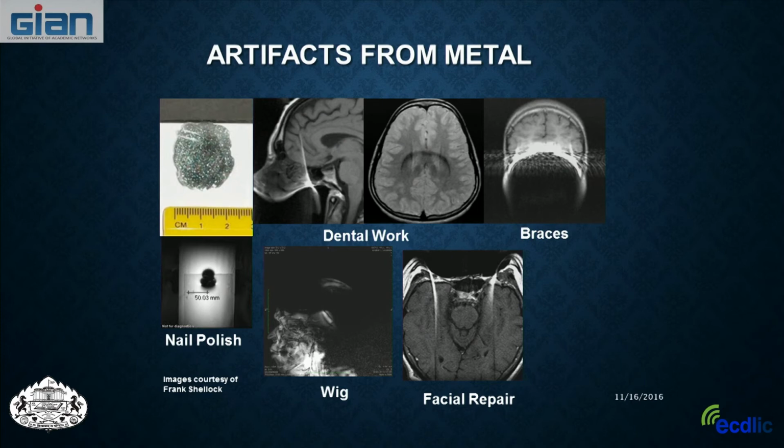When kids get braces to fix their teeth in their early teenage years, we interestingly had people that would swear up and down they had no metal. We asked specifically about braces. No, we don't have braces. The kid would come in and he'd smile real big and he'd have braces on his teeth.